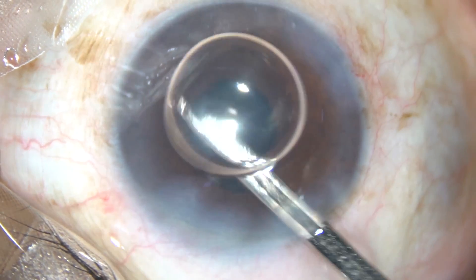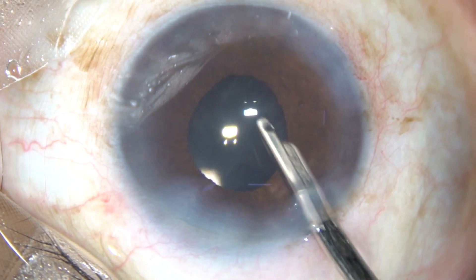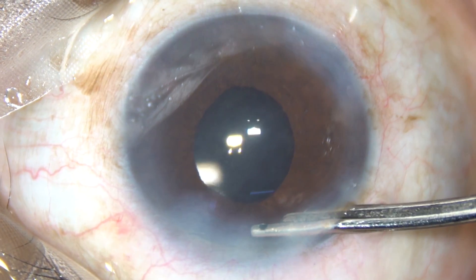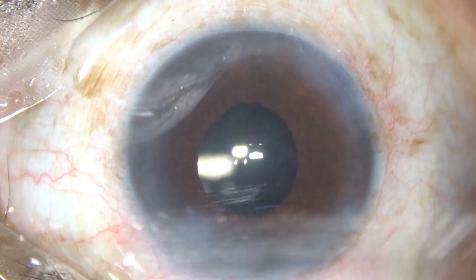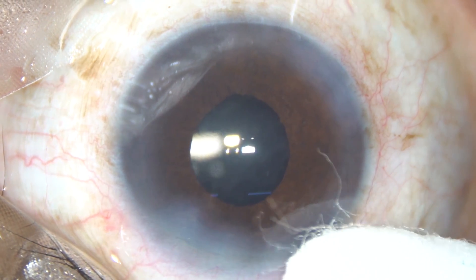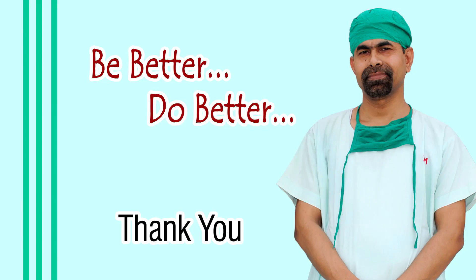This is the final lavage of the anterior chamber. The anterior chamber is formed nicely — this is how you form the anterior chamber and come out. Check the integrity of the wounds; there should not be any leakage from any site. Friends, thank you very much for watching. Hope this video will inspire you to do tough cases using proper tools. Thank you very much.